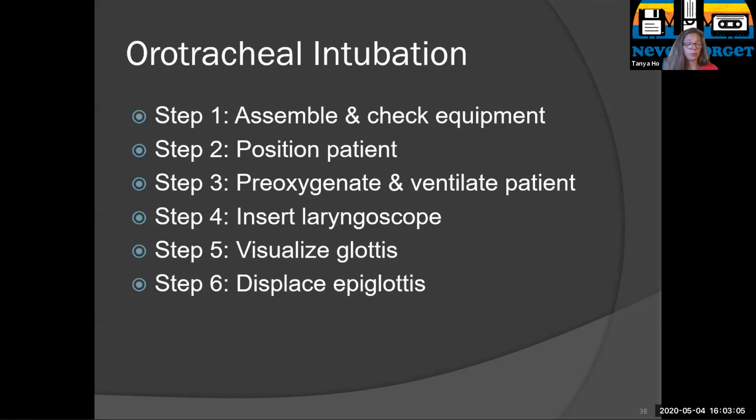Then you're going to check your laryngoscope and make sure that the light works, because that also is terrible and it looks bad on the whole department if they're about to intubate and then they open the laryngoscope and now the light doesn't work. That's awful. Of course, everyone looks to respiratory, and it's the absolute worst thing in the world. So don't let it happen to you, and make everyone look bad. You always check the equipment and make sure it works.